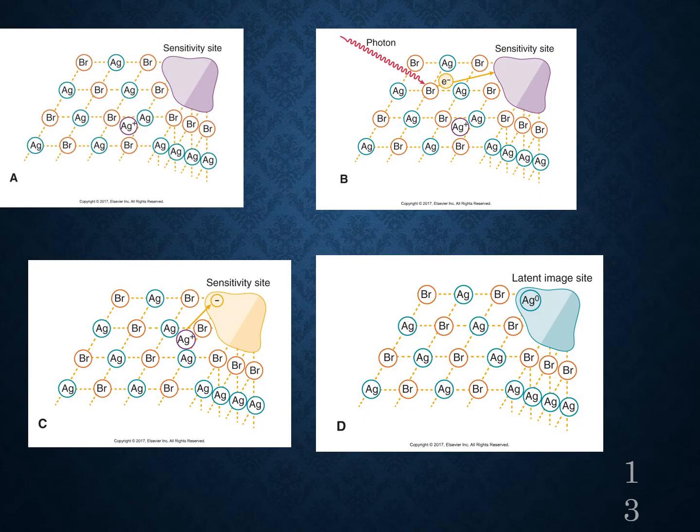All right, so this is figure 7-3. It's found on page 62. It's a wonderful visual representation of when that X-ray photon enters into the space, how it knocks off electrons, and so those electrons would be more attracted to the silver in the sensitivity site, and so the atom that's in there is now attracted to the sensitivity site, and so it moves further and closer to the sensitivity site, and then once it does so, it makes the silver a more complete atom.